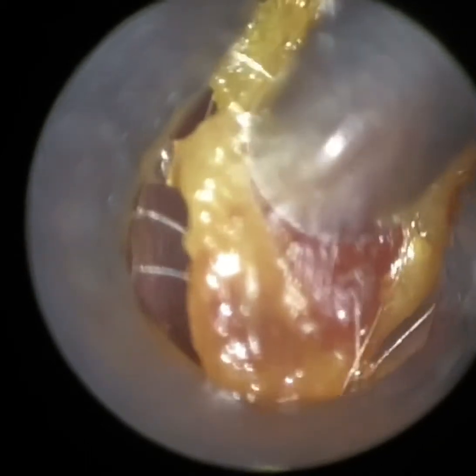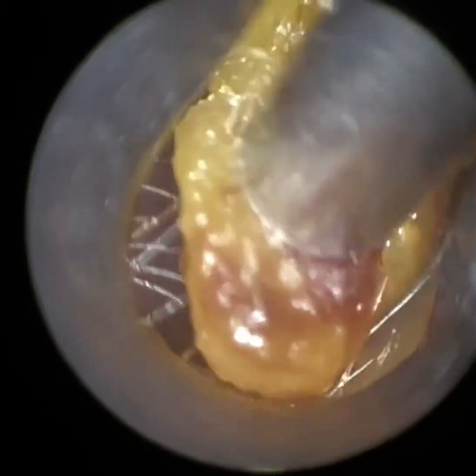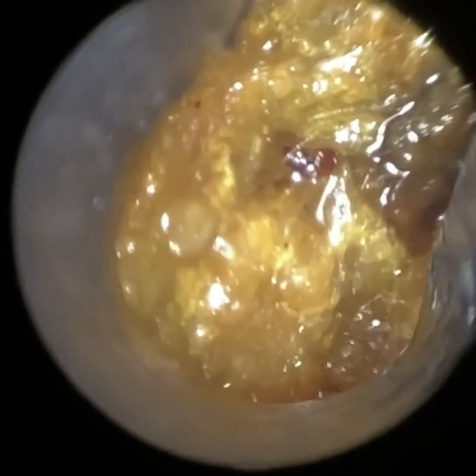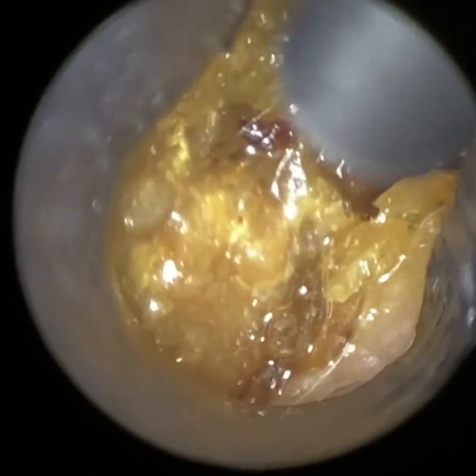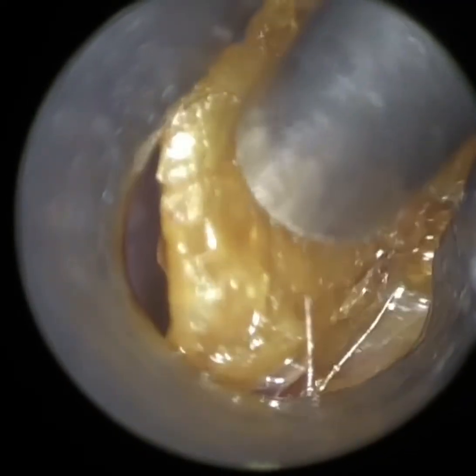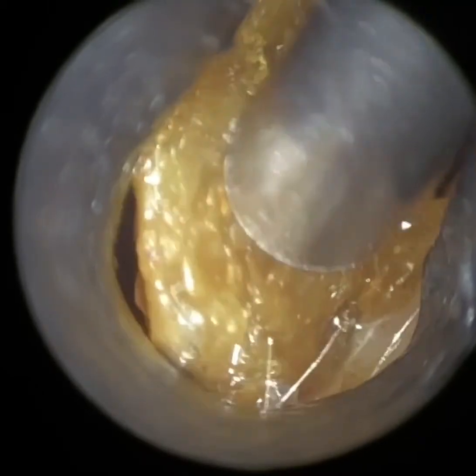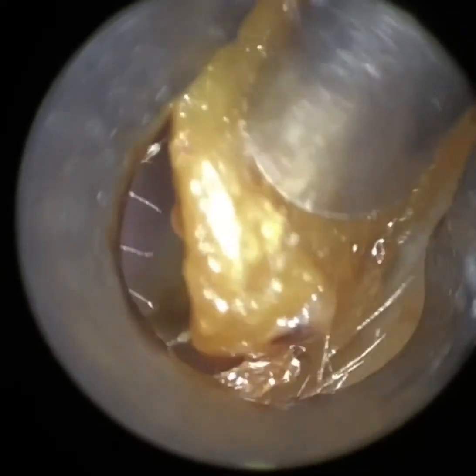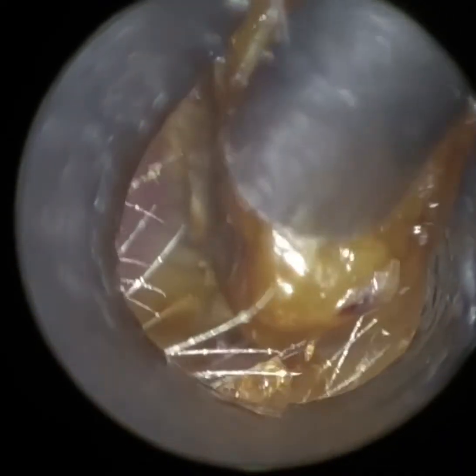Once I remove this large plug, the patient has very sharp and very uncomfortable shards of dead skin — it's almost like glass in the ear. You'll watch me not only remove this very hardened keratin and wax but also the shards of dead skin, including on the eardrum as well. You can see the oil in there and it has lubricated it slightly, but when you've got wax and keratin this hard, it's sometimes very difficult to get a suction grip. The slight problem is that you can push this further in because you're not getting a grip with the suction probe. You've got to really hover over the surface, and if you put too much pressure against it, you're just going to be pushing this plug further in and impacting it against the eardrum.